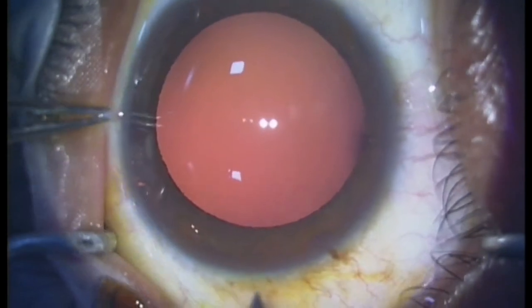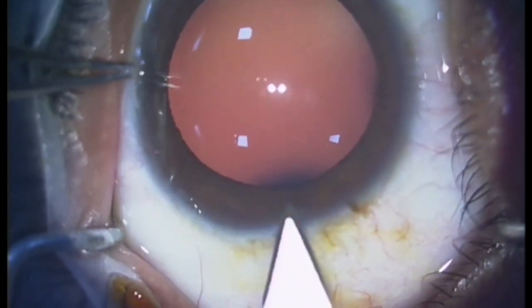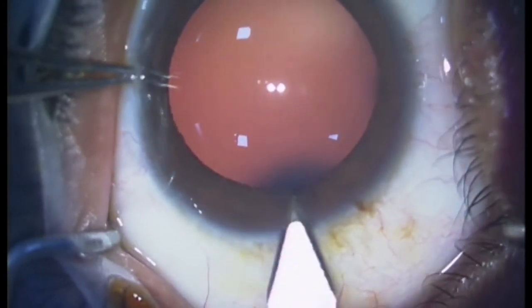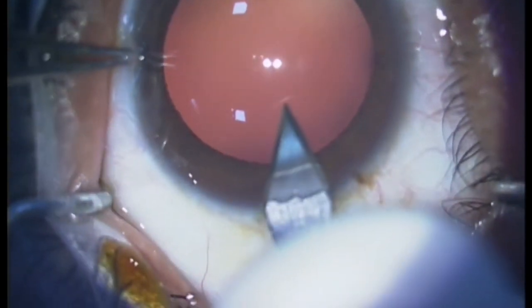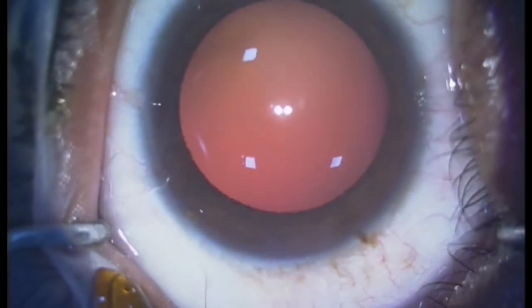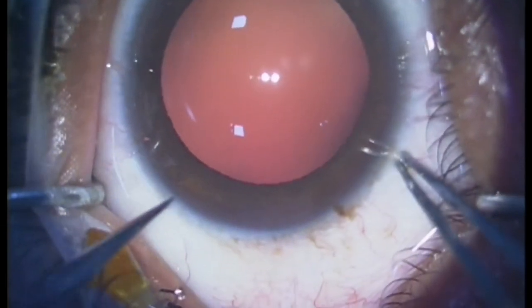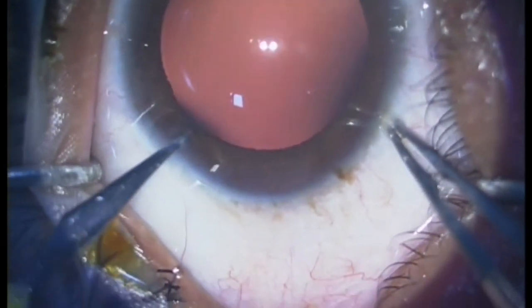A 2.8 self-sealing clear corneal temporal incision is constructed. A side port is made along the supero-temporal quadrant.